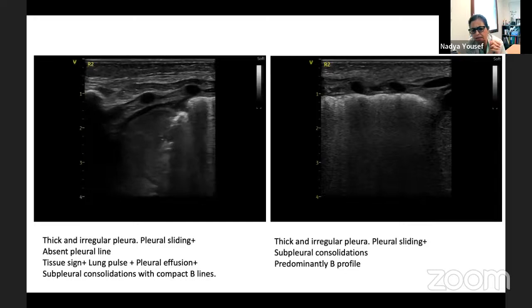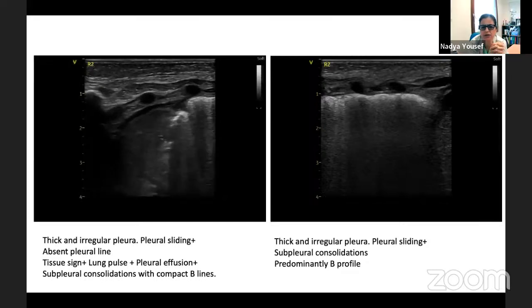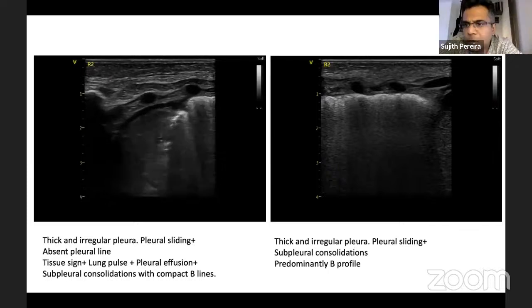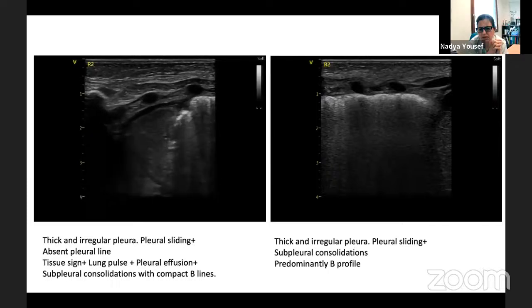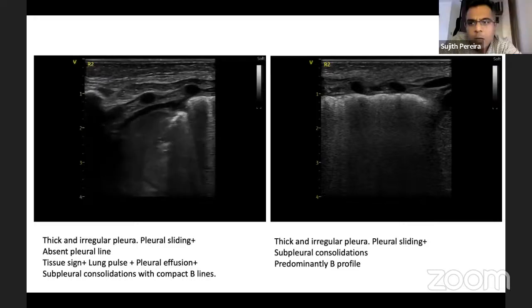And what did the CT scan show? This could be just chronic lung disease. There's no malformation or anything like this. No, they didn't find anything else on the CT chest. It's a bit unusual, though, to have the same image persisting at the same place over time, also on your lung ultrasound scans. It doesn't really make sense, does it? Yeah, it's a bit odd.